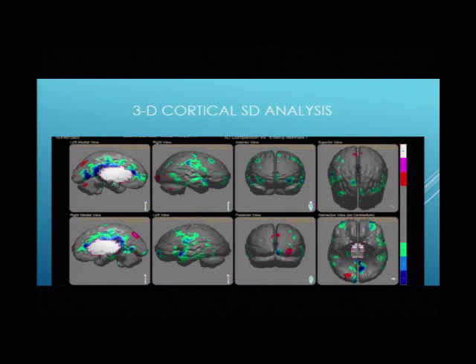So if this patient who got hit on the head has decreased blood flow, like we've seen in all these pictures, and it's significantly decreased, there's going to be a negative deviation from the norm. And if he has too much blood flow, there would be a positive. We see that all the time on the quantitative EEG. What you see here on the base of the brain, the same view, is all green, which is -2 deviations. Anything at 2 deviations or more is considered abnormal.